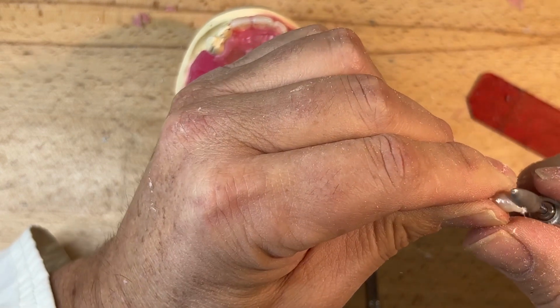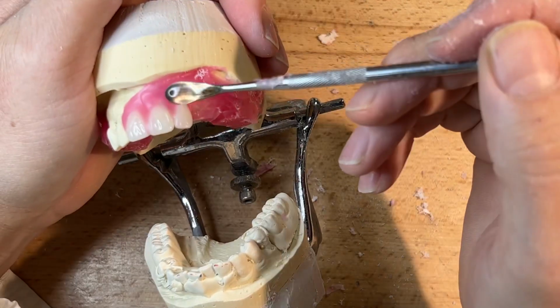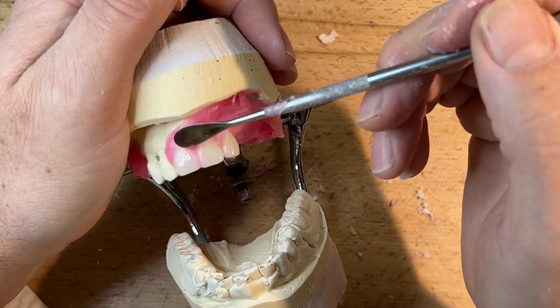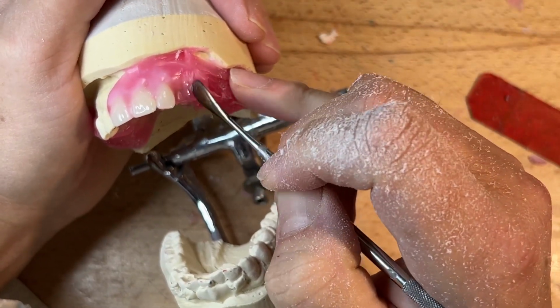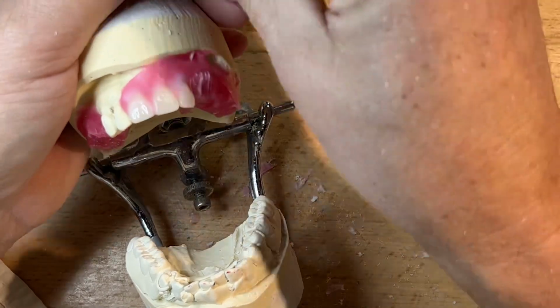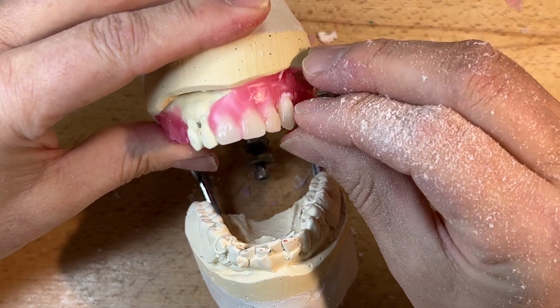I haven't even tried the canine, but I just know visually I'm going to have to reduce the ridge lap. Kind of going back, adding some slight wax. If you wait to the end and add all your wax at the end after the setup, you run the risk of having too much shrinkage of the wax, depending what kind of setup wax you're using. This is really basic. I think number 2 base plate wax.